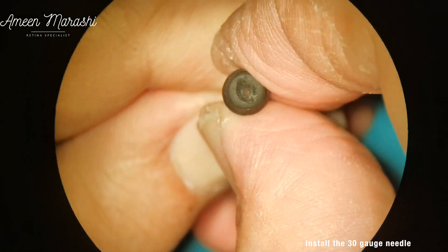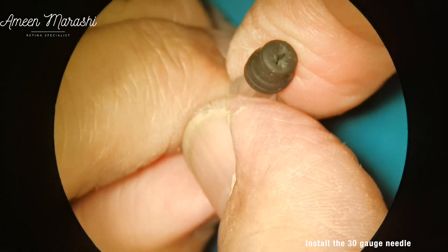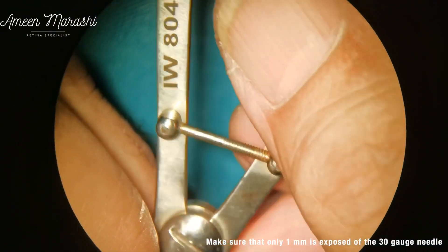In cases where the exposed part of the needle is less than 1 mm, the ring measurement of the earlier prepared plastic luer slip is rasped again until the appropriate measurement is achieved.